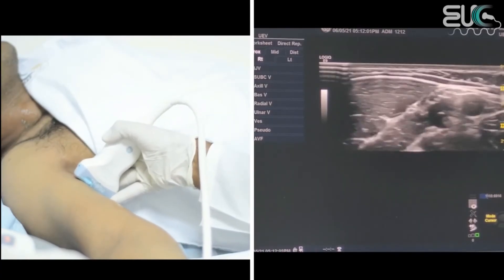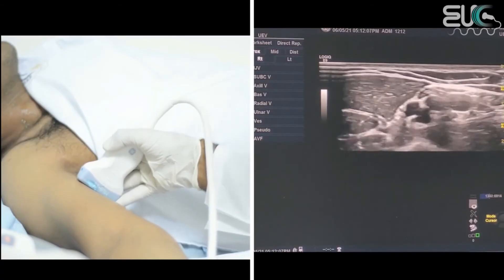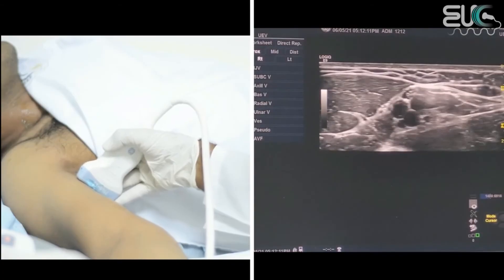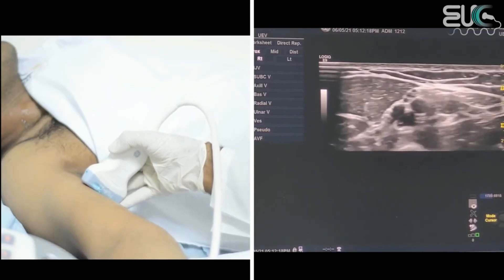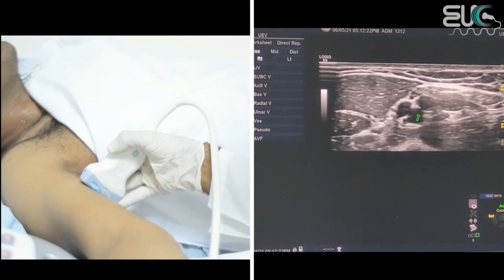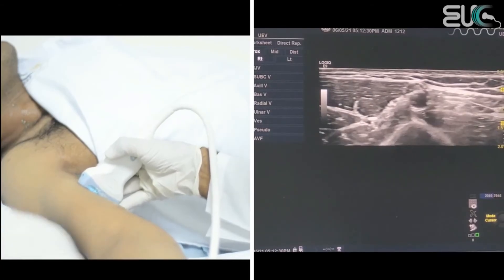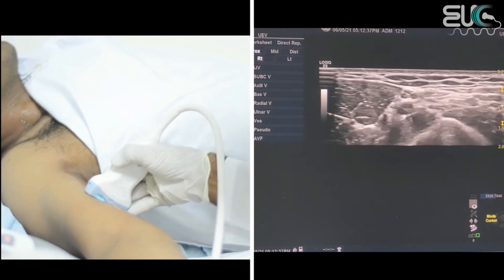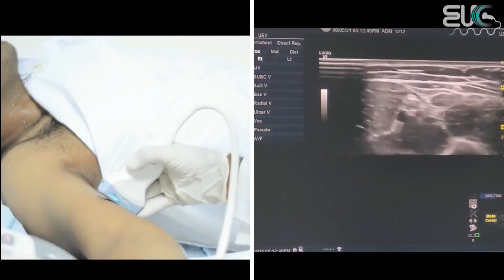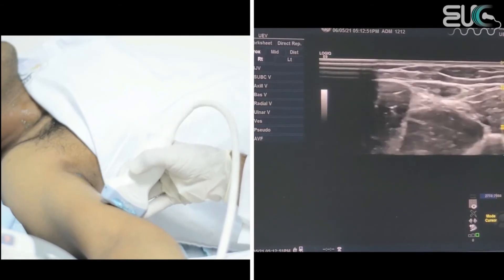Now I will go back to follow the brachial vein. Opposite to the lower extremity, the brachial vein may be two veins or sometimes one, so you have to be aware of that. Here I think we have two brachial veins — one here and one here — with the accompanying brachial artery. I will check compressibility and both are totally compressible. Then I will check at the mid arm — here we have brachial vein one and two, and when I compress, both are totally compressible.